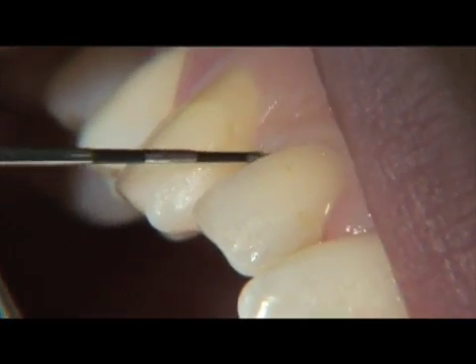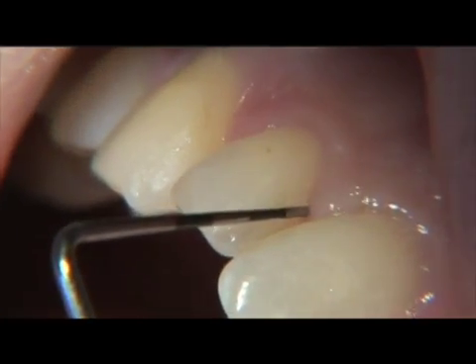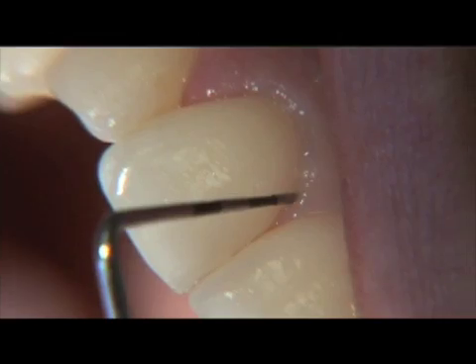Initially, one must perform full periodontal probing in order to establish periodontal case type, and then by utilizing probing depths, set the fiber length to the maximum pocket depth for the tooth to be treated.